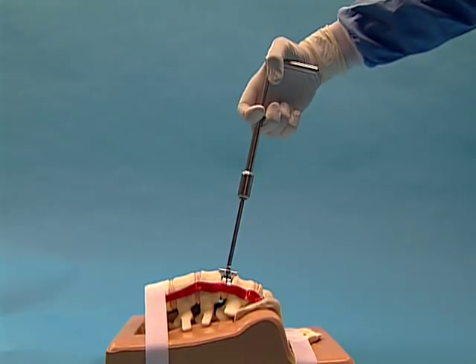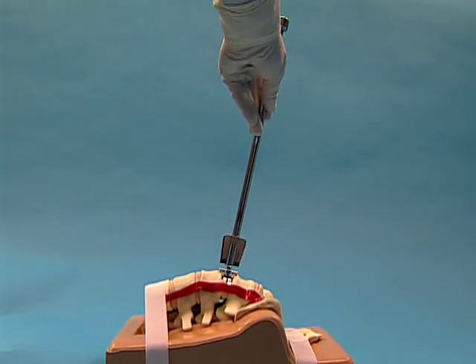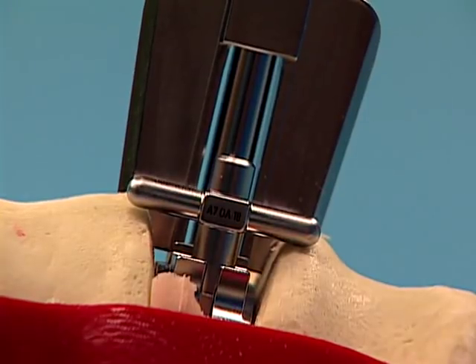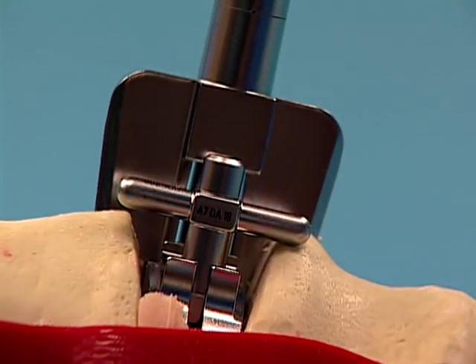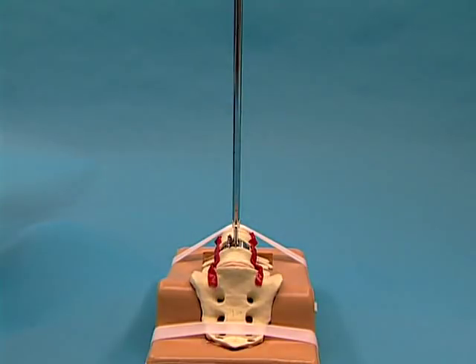Remove the handle from the trial. Slide the chisel corresponding to the trial height onto the shaft of the trial. Under lateral fluoroscopic control, advance the chisel into the vertebral bodies with the slotted mallet until the chisel is fully seated on the trial, ensuring that the trial stop is resting on both vertebral bodies. Leave the chisel and trial in place until the ProDisc-L implant is ready for insertion.